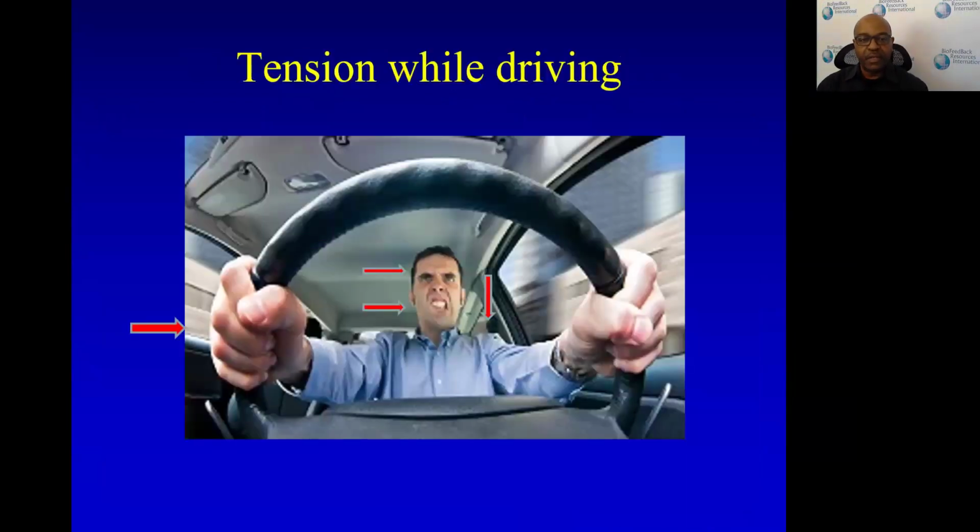And this is another one, driving, and a person tensing unnecessarily while they're driving. How tight are they holding the steering wheel? You really don't have to hold it very tight to effectively drive the car, but sometimes because of stress that's going on, it's something that people do. And then facial tension, of course, this is a little exaggeration, but maybe not.